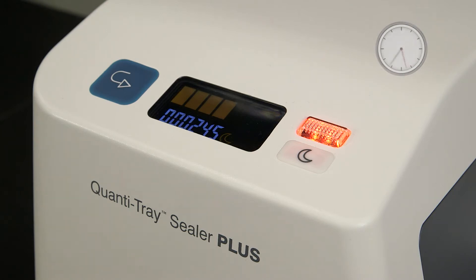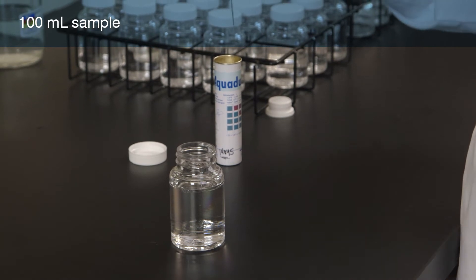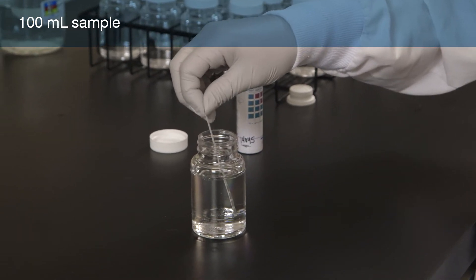Turn on the sealer and then wait until a green bar appears on the display. The sealer has now reached the appropriate sealing temperature. Collect a 100 ml sample in a sterile vessel and bring the sample to room temperature.